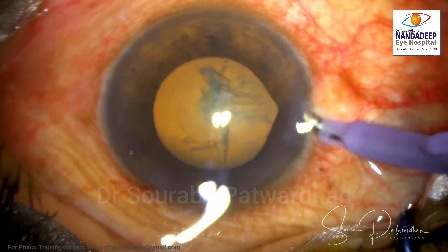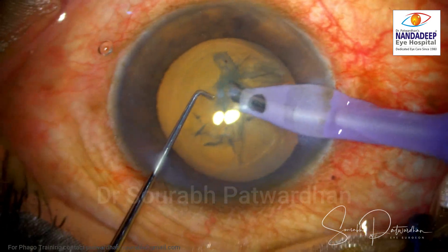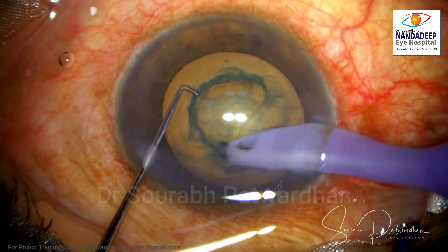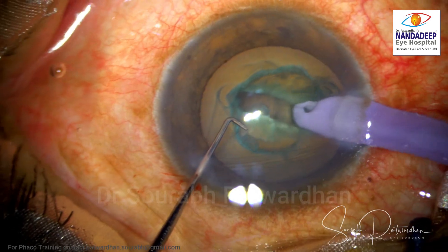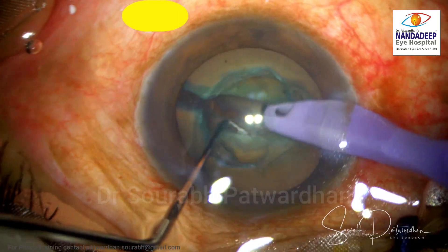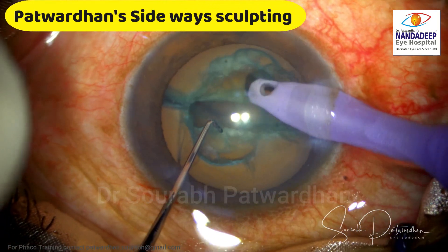So this is a case where I have not done any hydrodissection. I entered the anterior chamber without the irrigation on, to avoid iris prolapse. And then I started grooving and trenching, which I do in all cases. The first central trench is done and I could divide the nucleus very easily. Now I try to rotate the nucleus, but because of lack of hydrodissection, I cannot.